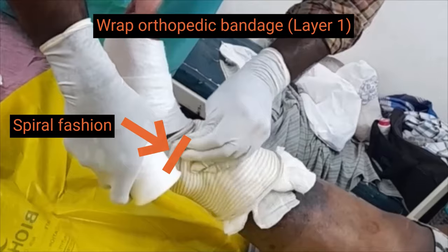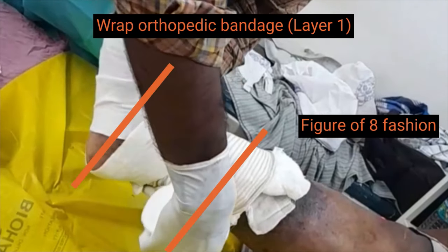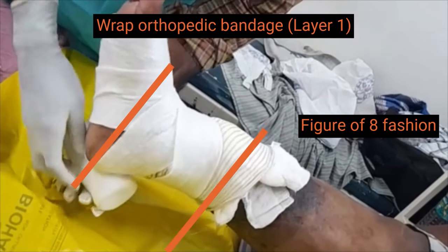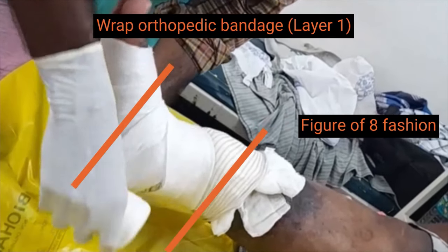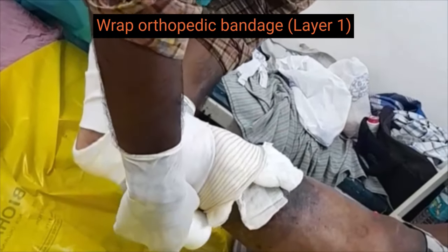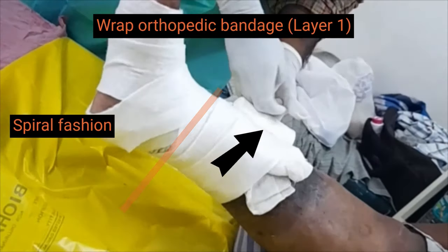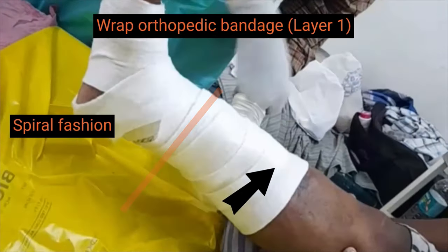At the ankle, the bandage is wrapped in a figure of 8 manner. Above the ankle, an orthopedic bandage is applied in a spiral manner with 50% overlap.